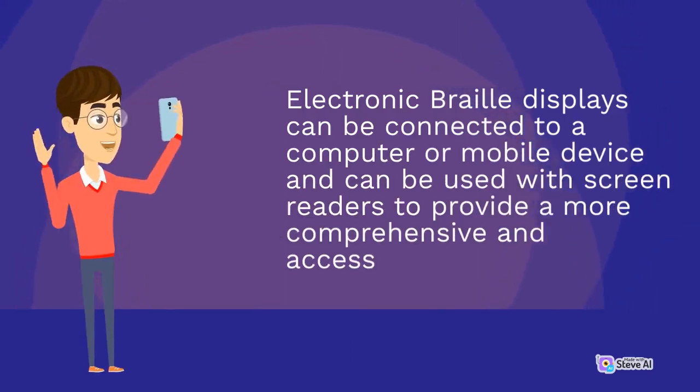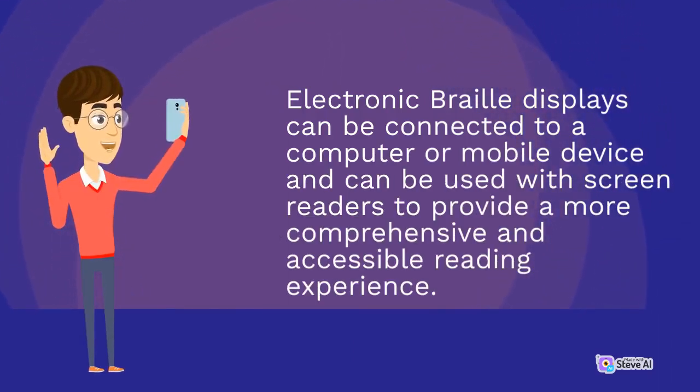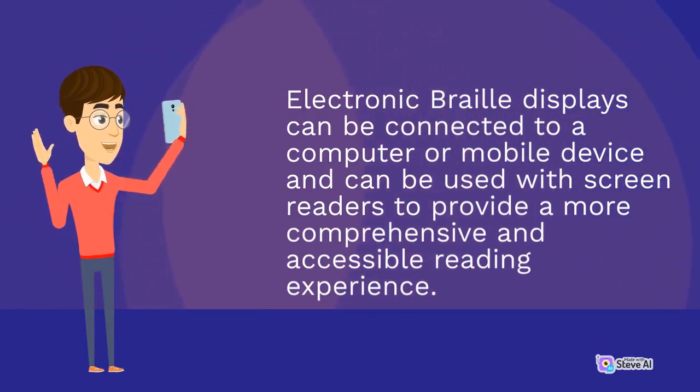Braille displays can be connected to a computer or mobile device and can be used with screen readers to provide a more comprehensive and accessible reading experience.